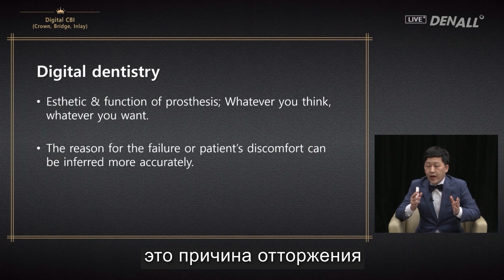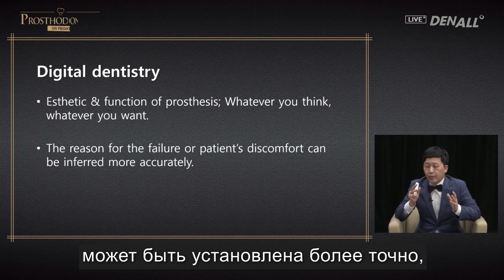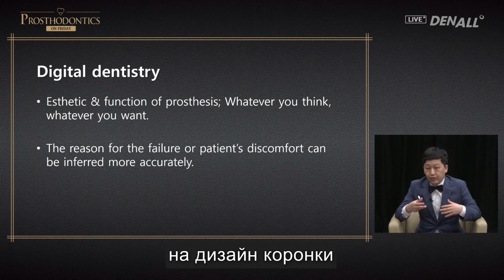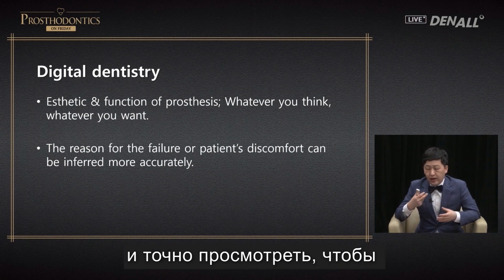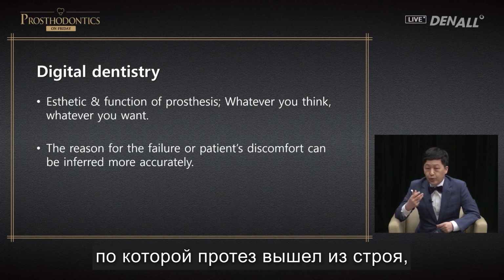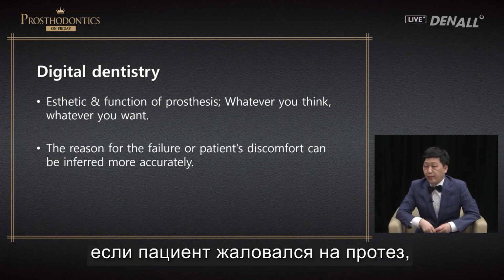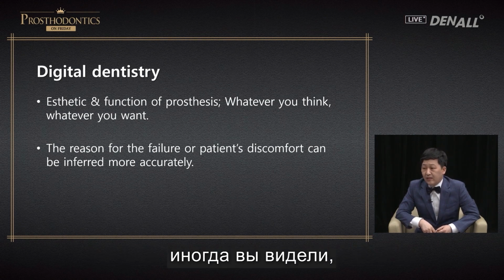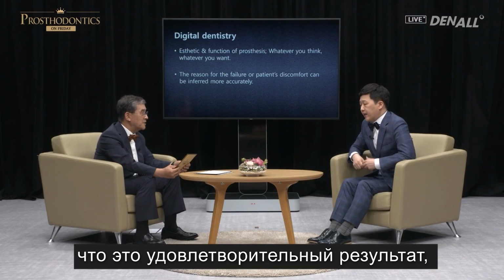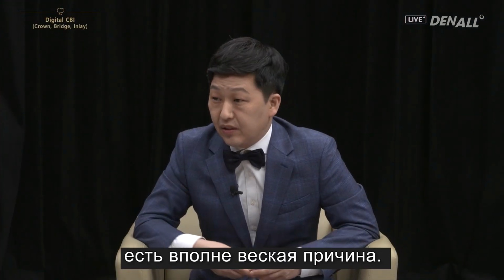the reason for the failure or patient's discomfort can be inferred more accurately because we can look at the designed crown and review accurately, so we can assess the reason why the prosthesis failed and the patient is experiencing discomfort. In the past, if the patient complains about the prosthesis, sometimes you see dentists saying that this is as good as it gets. You try to convince the patient that it is a satisfactory result. However, I realized that there's quite a good rationale behind such discomfort and complaint.